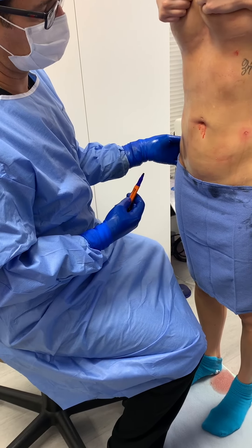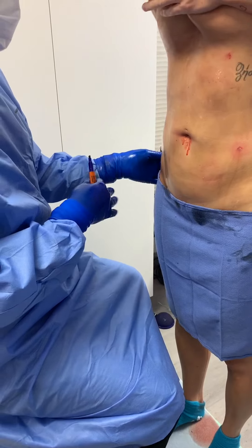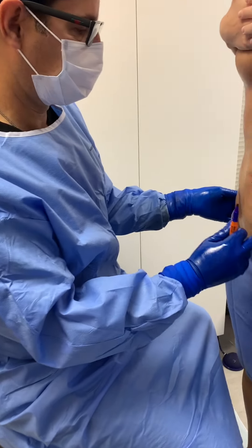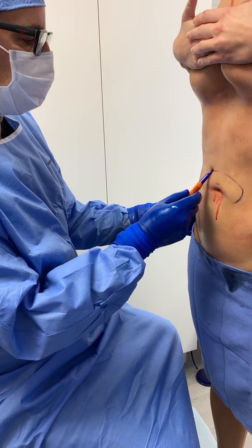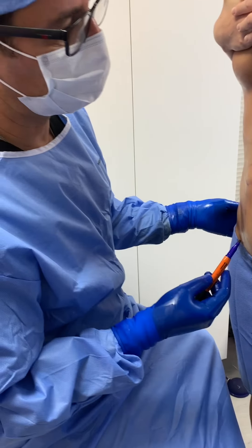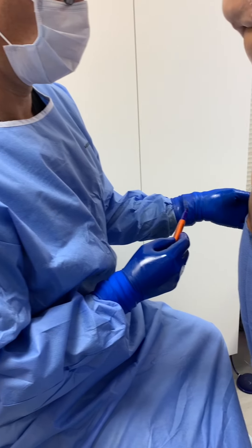One of the advantages of doing awake liposuction — keep in mind we just did her entire abdomen and she's swollen with tumescent — but I'm looking for symmetry and I'm looking to make sure that we haven't missed any parts. All of this is just fluid. She's skinny mini and I'm going to come in and just take a little hint of something up here above her belly button, but we have really snatched her well and we're going to roll her around on the stomach and do a fat transfer as soon as I just do a little minor touch up there on the belly button.